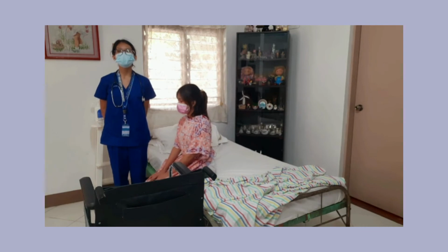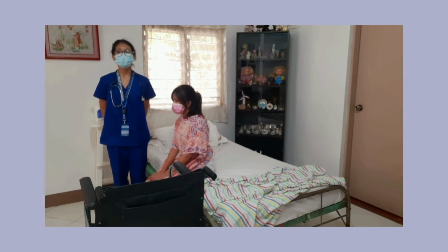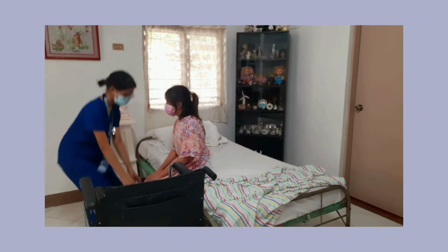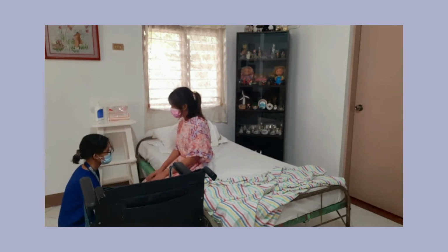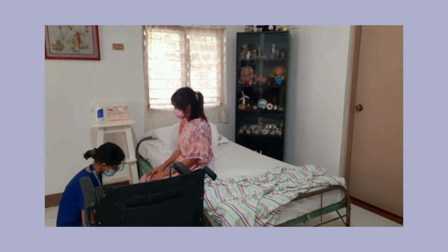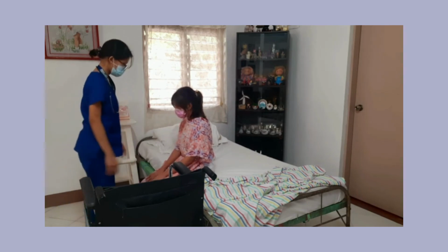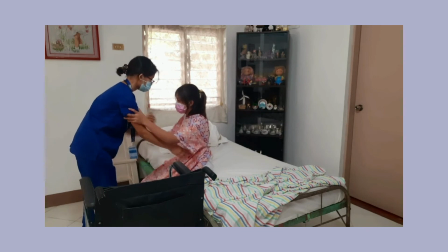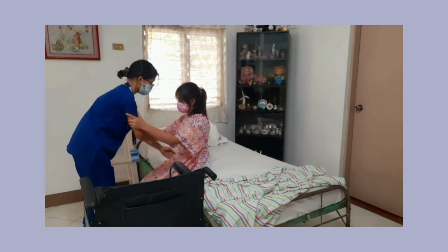Place the client's hand on the bed surface or on your shoulders so that the client can push while standing. Now, ma'am, I want you to put your hands on my shoulder. Okay.